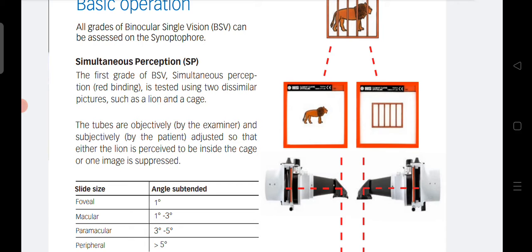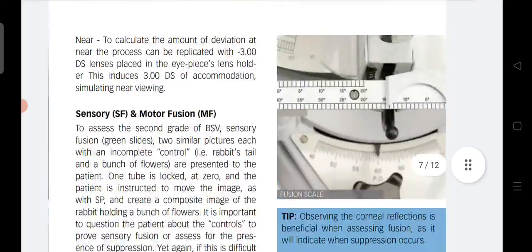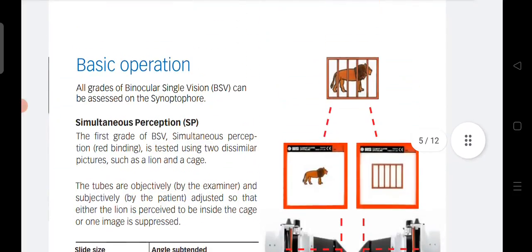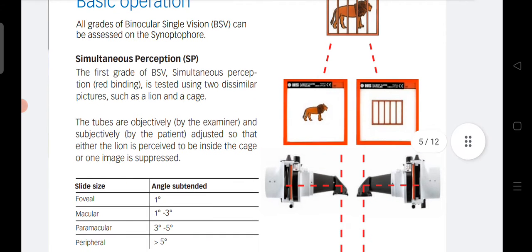So if there is a lion and a cage — the lion is seen by the left eye and the cage by the right eye — and if you have simultaneous macular perception, you will see the lion inside the cage. Now, these are the tubes of the synaptophore; you can see the eyepiece there.